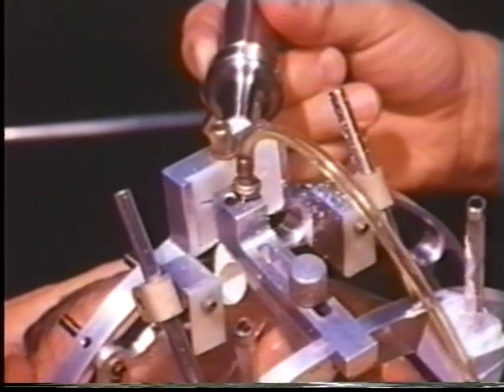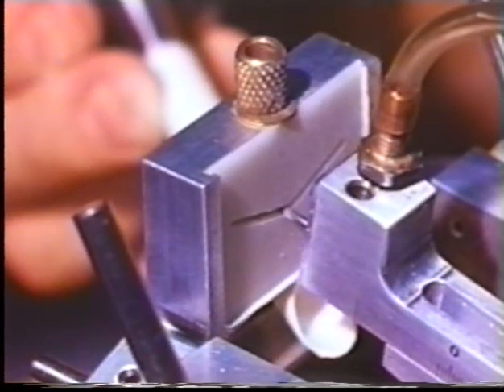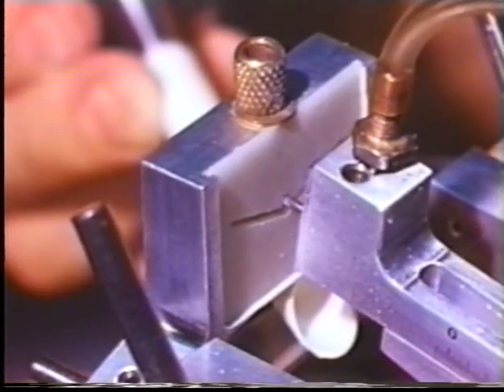The mandible is returned to centric relation and the recording of the protrusive movement is made in a similar manner.